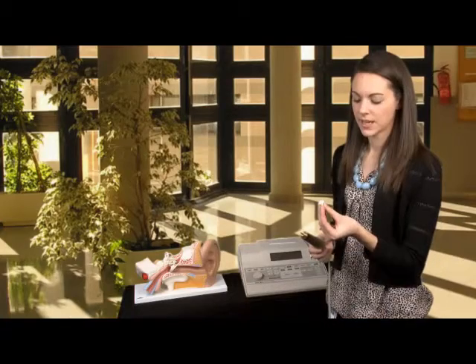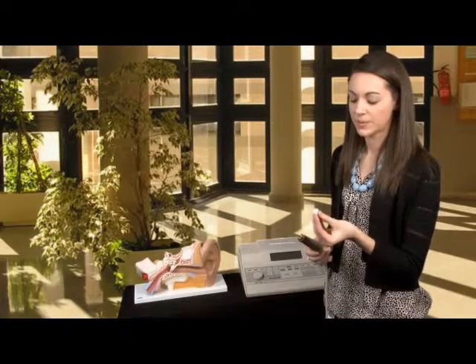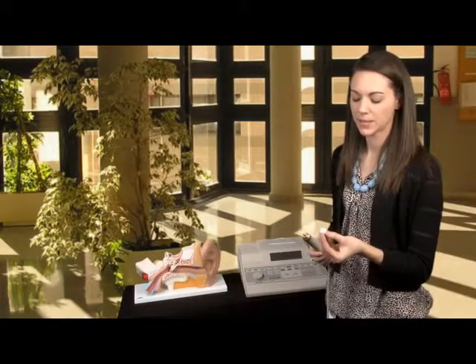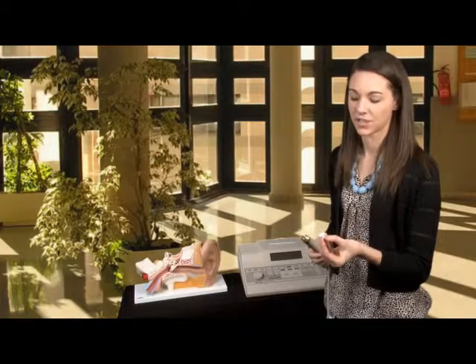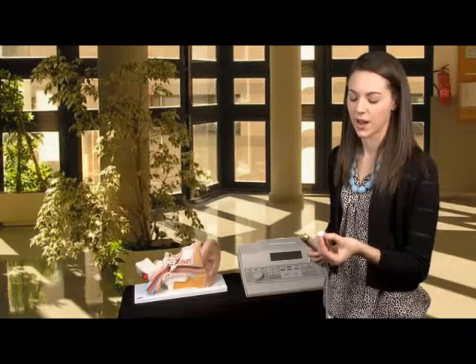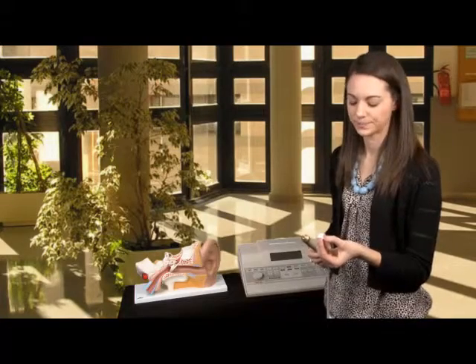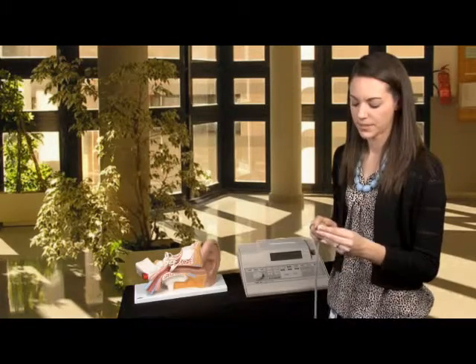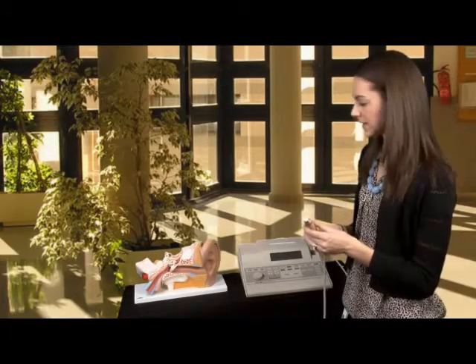This is what we call a probe tip. It's important to get the correct size of probe tip so we can create an airtight seal in the external auditory canal, because we can't do the test without an airtight seal. So I'm going to put the probe tip on the probe just like that.